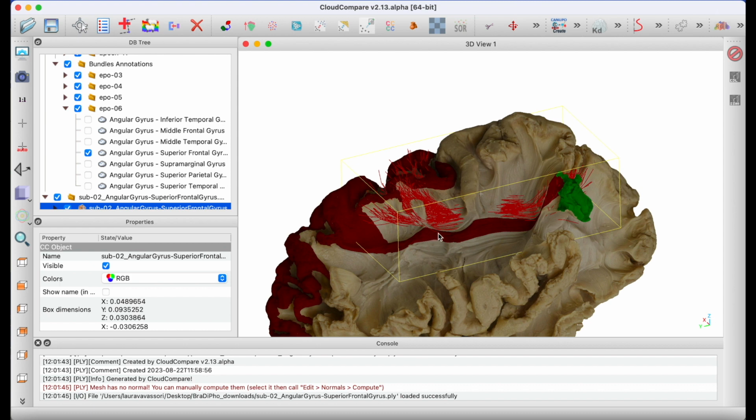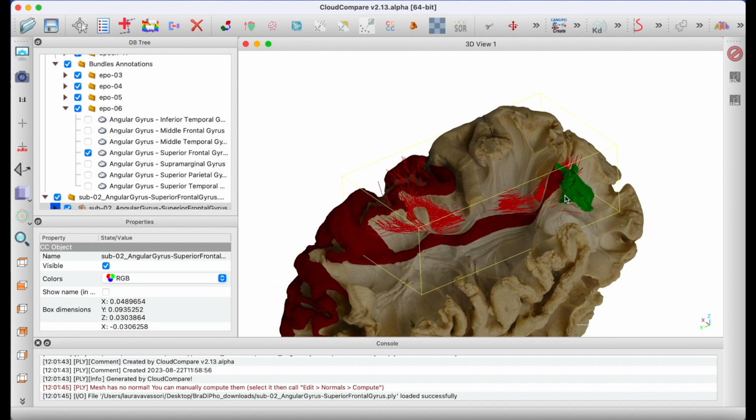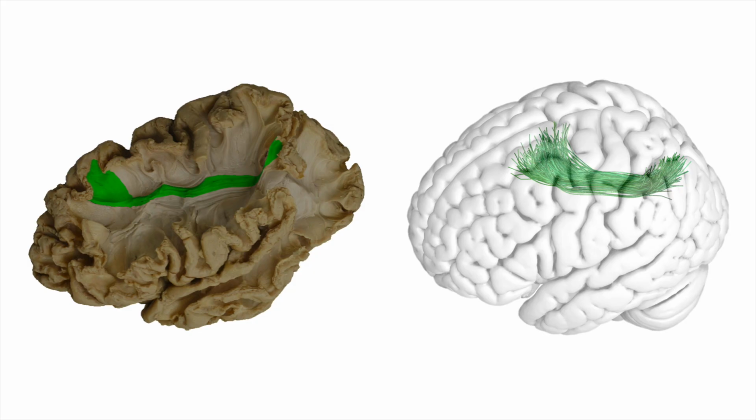So on one hand, this does not tell me that my tractographic reconstruction is anatomically unreliable. Still, there are two things that really strike me. So first of all, if I would have done a canonical comparison between my tractography and a dissection picture in two separate spaces, I could have stressed that this connection exists, and then it would be chapter closed.